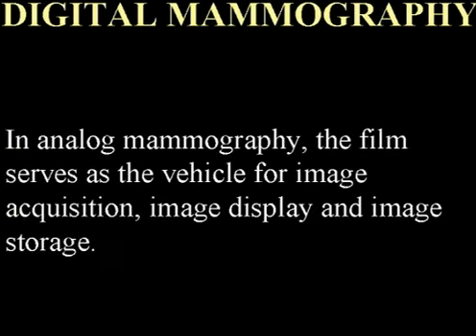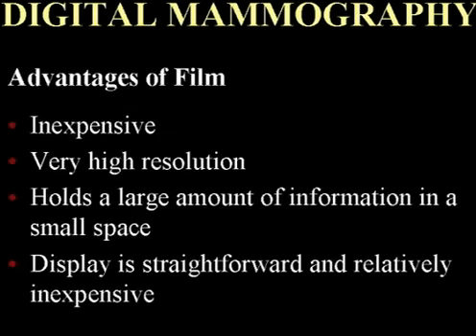So when we look at that construct, we can see that the analog film is serving as the vehicle for the acquisition, the display, and the storage of the image. Now, in many ways, this is a highly efficient process. It's inexpensive. The film itself is extremely high resolution. I love it when the residents say they'd rather read MRI or CT because it's very high res. Well, there is no higher resolution examination in radiology than mammography. It holds an enormous amount of information in a very compact package, and its display is quite straightforward.